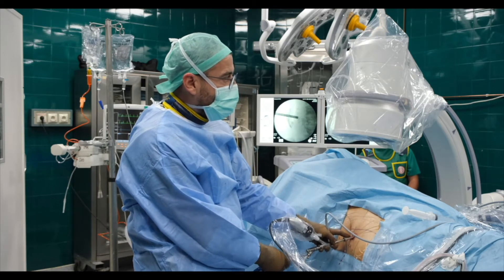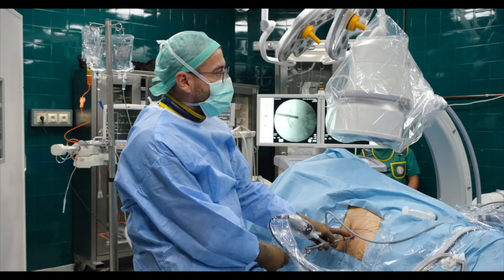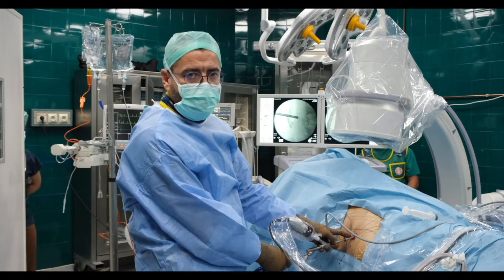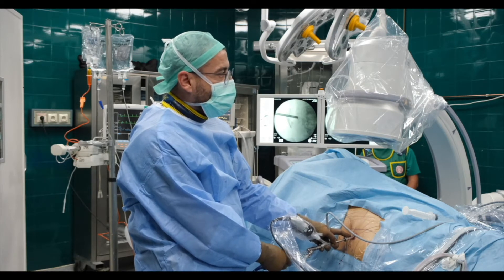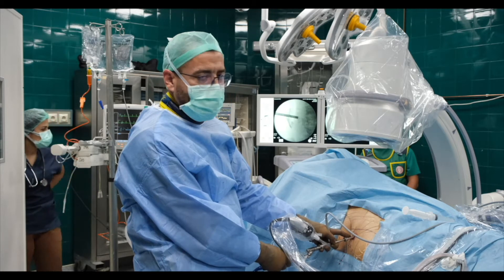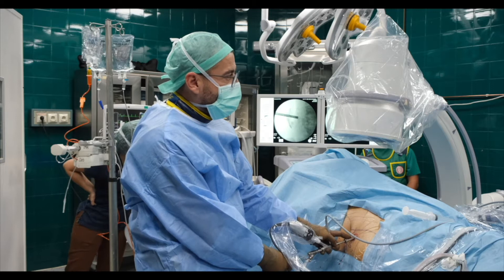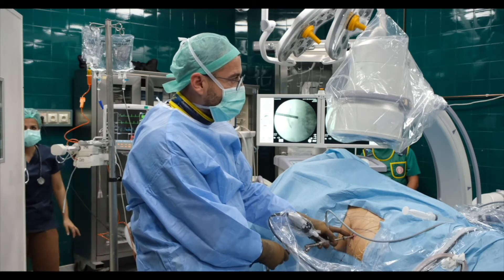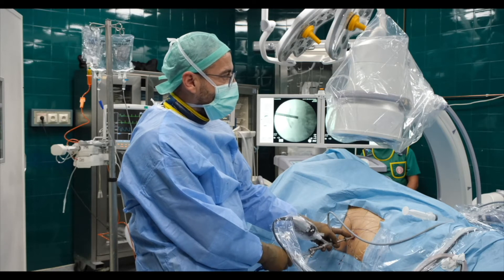During fragmentation, the main technical point is to fragment the stone from the peripheral part. You also have to push your probe back and forth in order to make the lithotripsy more efficient.